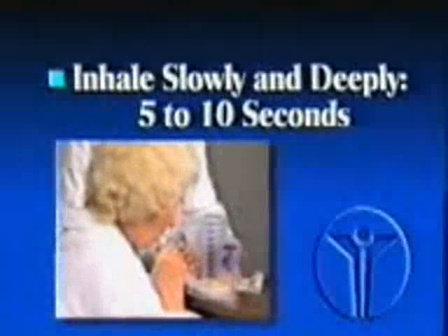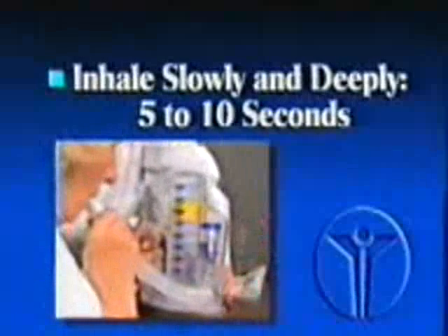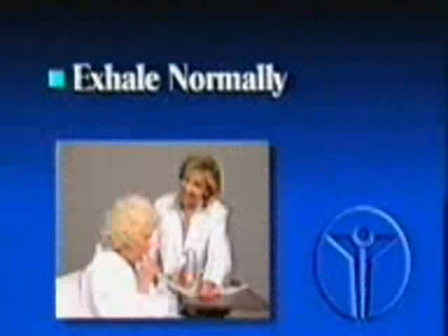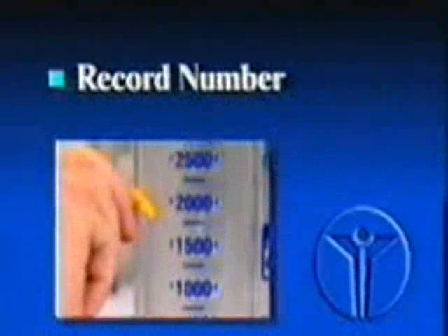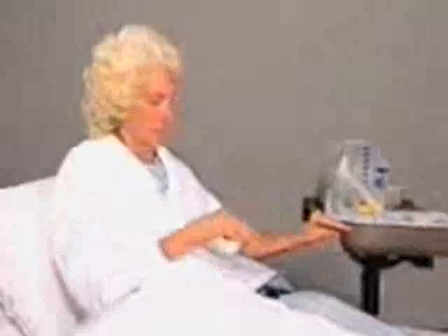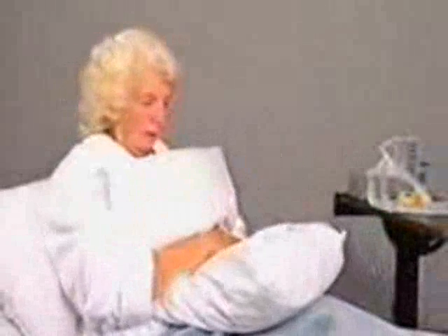Now, repeat the exercise. Inhale slowly and deeply, keeping the yellow inspiratory coach close to the happy face. Hold your breath for six seconds. Relax and exhale normally. Record the number closest to the top of the large yellow piston. After you have completed the prescribed number of deep breaths, you should cough several times to clear the breathing passages of any congestion. If you have had surgery, it may be helpful to support the incision with a pillow while coughing.